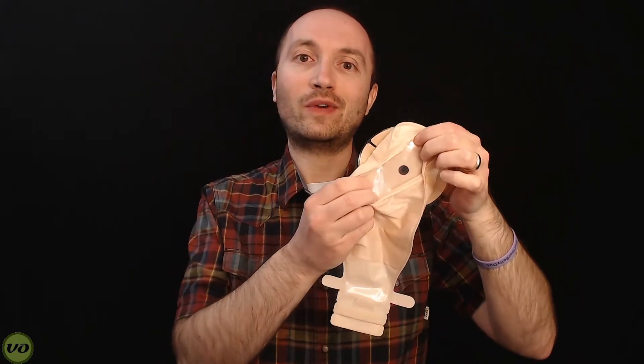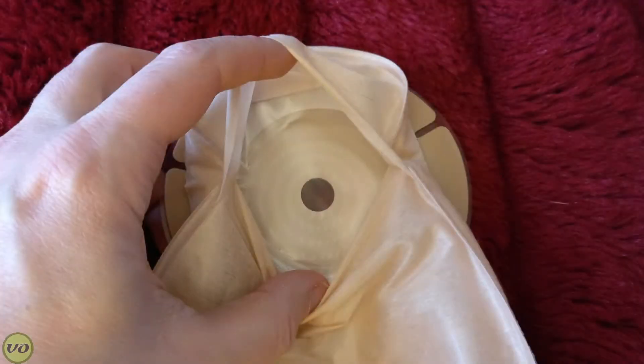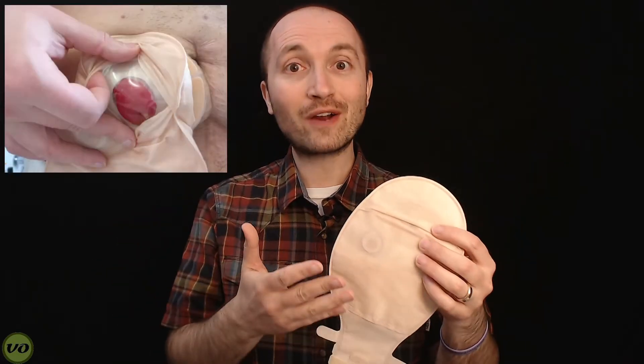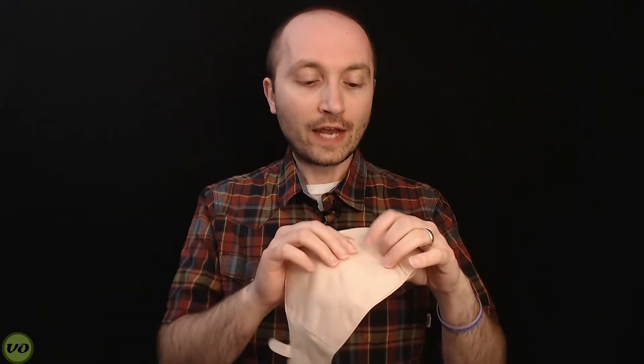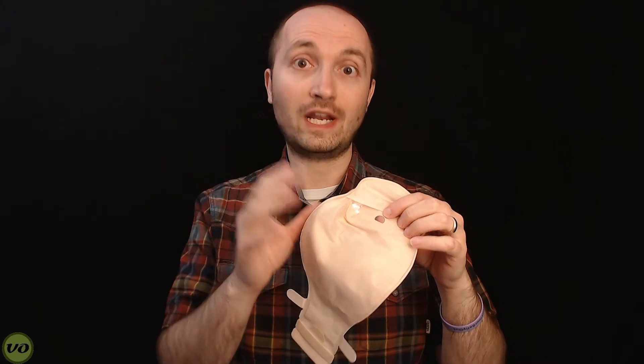Another thing you're going to notice about this bag is that it has an inspection window. This is something that I really appreciate on opaque bags. It helps me to fit a one-piece appliance on a lot better than not having it. And for some people who don't want to go fully transparent, that's a really good compromise. It's also good to check the contents of your pouch — whether you have gas or need to empty — and it allows you to inspect the wear around your stoma and make sure the integrity of the wafer is still holding out nicely.